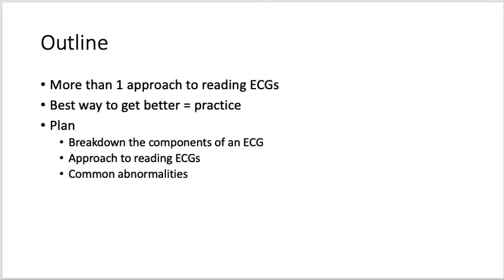You may not be able to explain exactly what the pathology is that you see happening at that time, but at least you'll be able to read an ECG and recognize what is abnormal from a normal ECG. This allows you to at least triage and escalate to any senior staff if you need any help, or at least be able to explain what is normal or abnormal about an ECG when the consultant asks you.